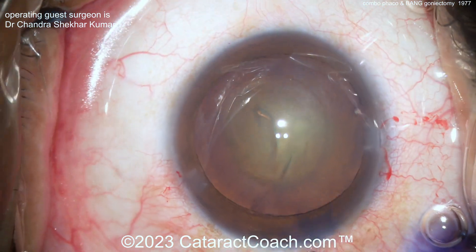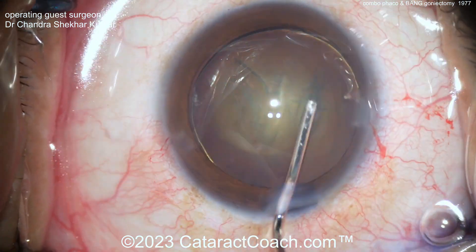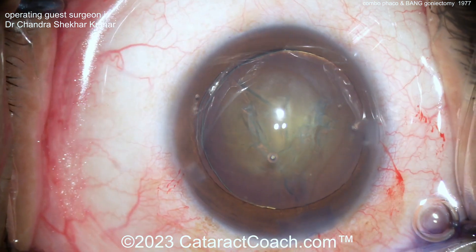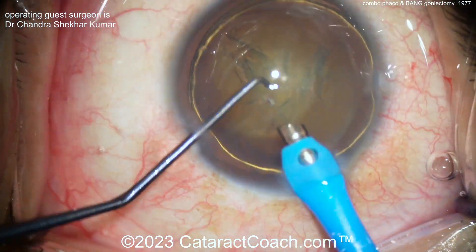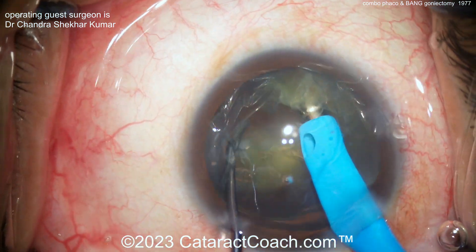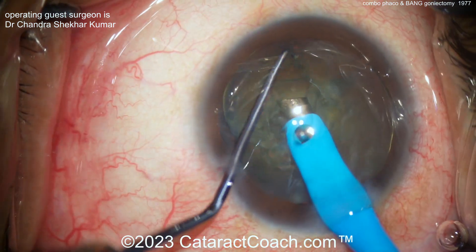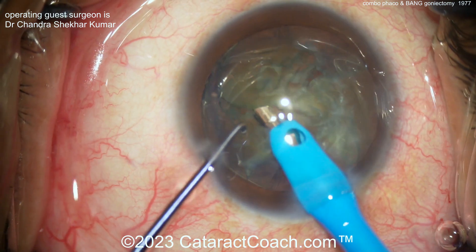Also, look at the incision. This is a case where you don't want to hit too much of the limbal vessels. Why? Because if you have too much bleeding from the incision sites, when you put the viscoelastic on the cornea to get that gonial prism coupled, you could get blood obscuring your view. This surgeon has done a beautiful incision — you can barely nick vessels, or even go totally clear cornea, because you don't want that bleeding.